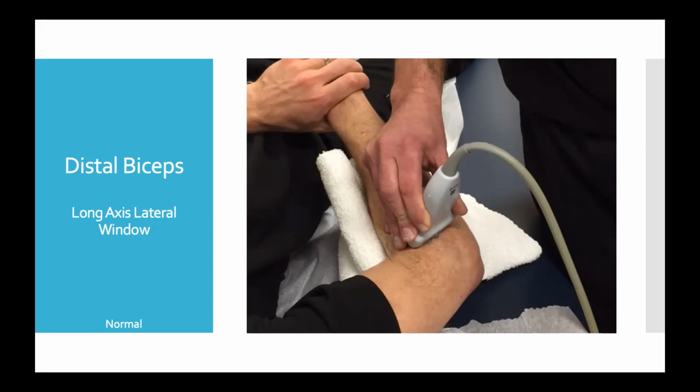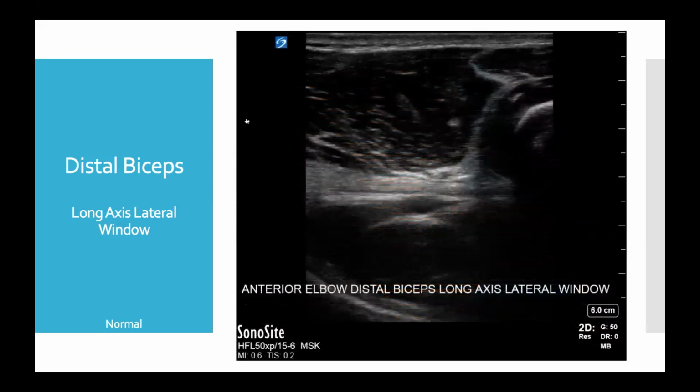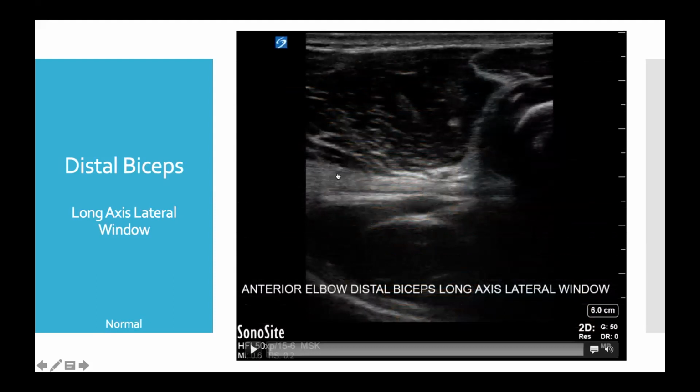So the first one is going to be a long axis view of the distal bicep through our lateral window with the patient's elbow at 90 degrees, and they're going to be supinating at the hand as we evaluate the ultrasound. And here we can see what we're looking for, and as we can see right here on the screen, we have our distal bicep coming in here.